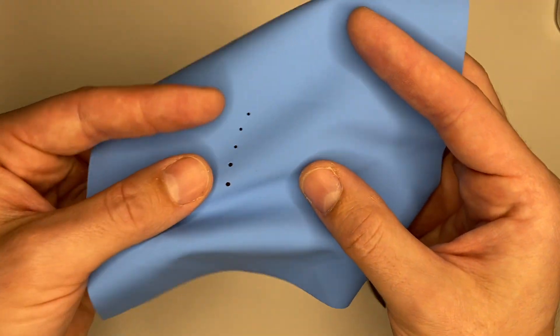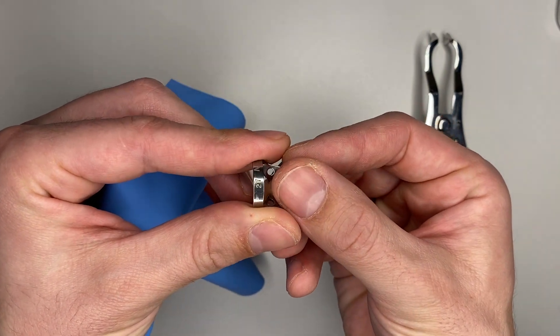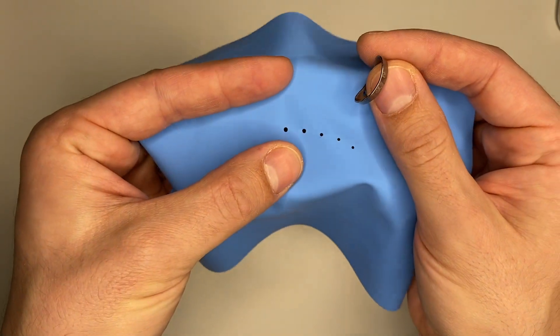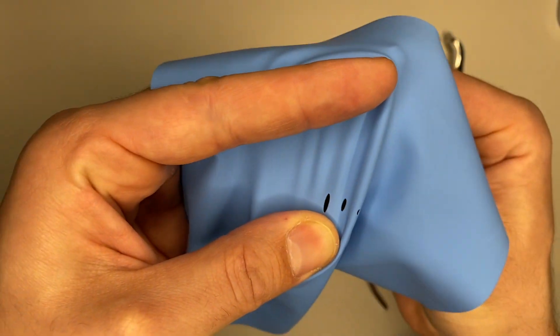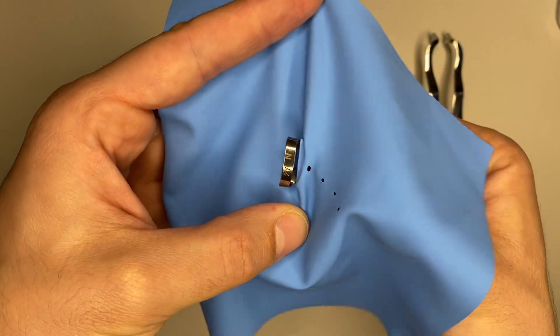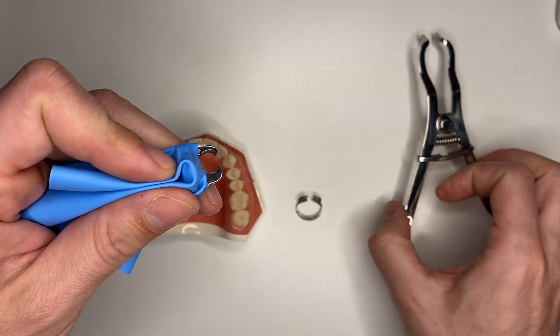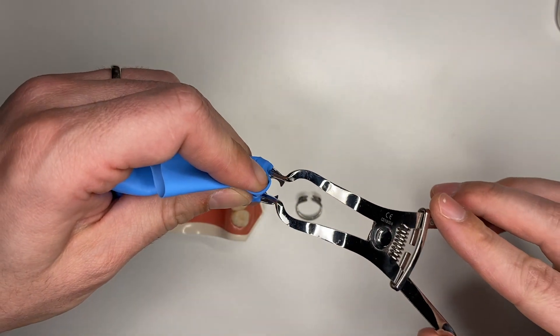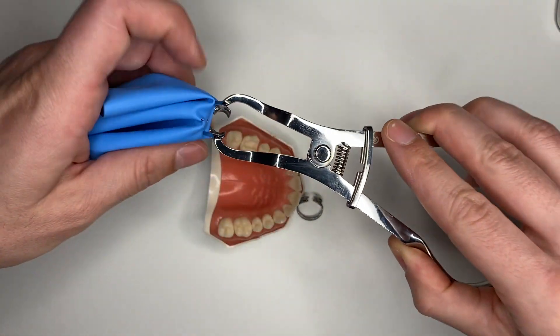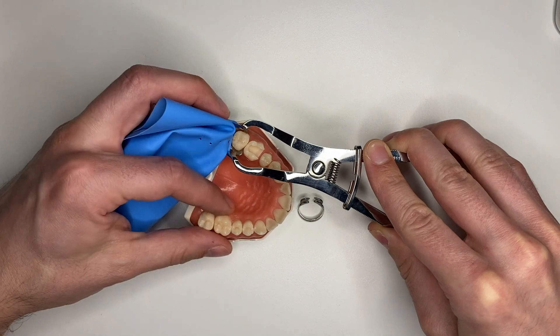First of all, we are going to use the 27 clamp and we are going to use a parachute technique, meaning that we are going to take the connector of the clamp and put it through the last hole like this. Then we are going to take the rubber dam over, and we're going to take our pliers and gently extend the jaws.